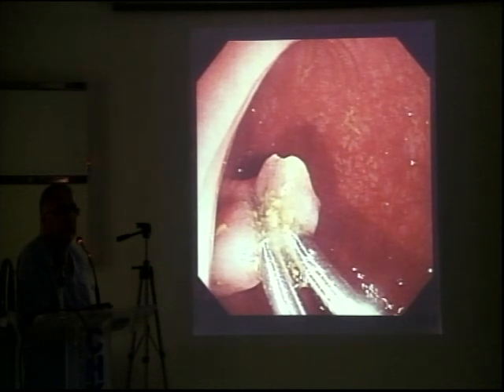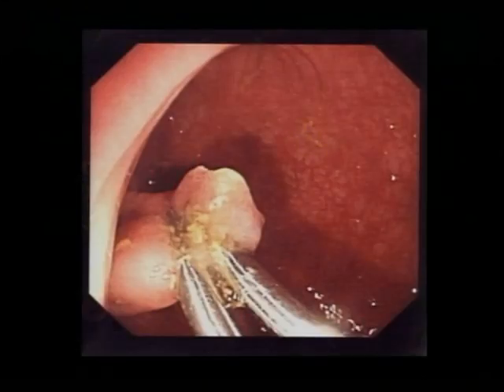The clips that you'll be using a lot use a system called ABBA, which is advance, back, back, advance. Advance means take the plastic sheath off so the actual clip comes out. Back means they actually open the clip. And then completely back to fire, but it stays attached to the actual clip.